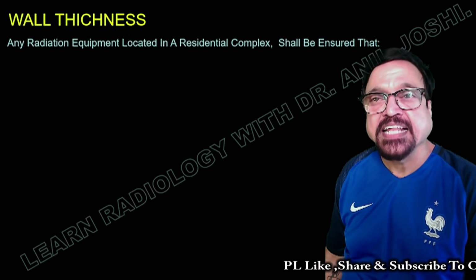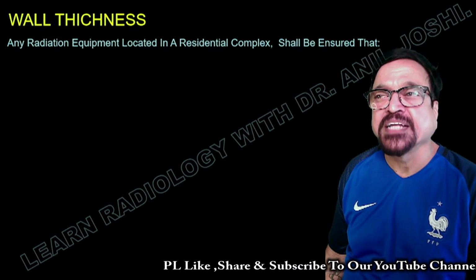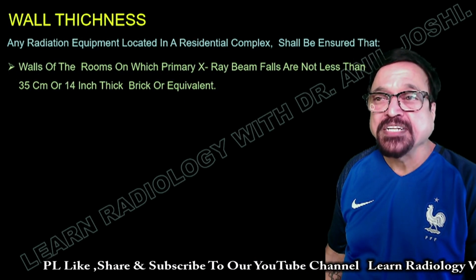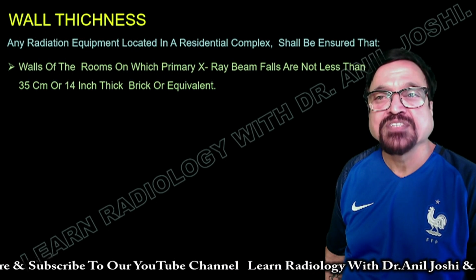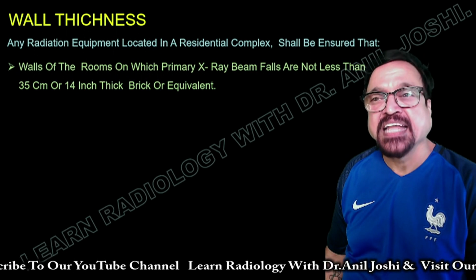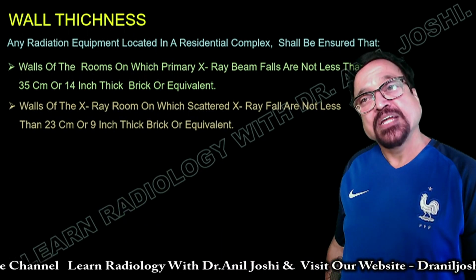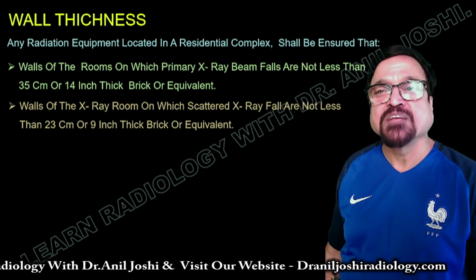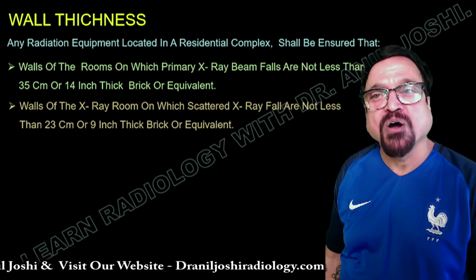Now what is the wall thickness? For any radiation equipment located in a residential complex, it shall be ensured that the wall of the room on which the primary X-ray beam falls is not less than 35 centimeters or 14 inches thick, either brick, concrete or their equivalent. Walls of the X-ray room on which scattered X-rays fall are not less than 23 centimeters or 9 inches thick, either concrete or brick equivalent.